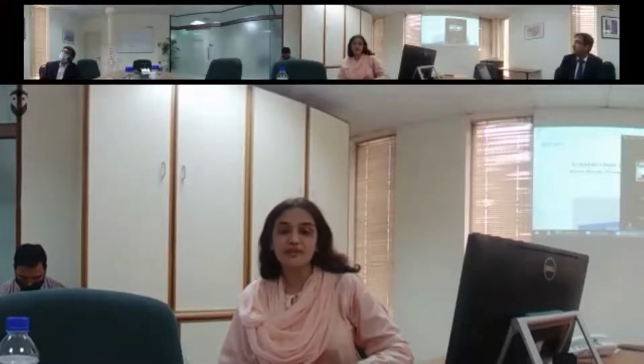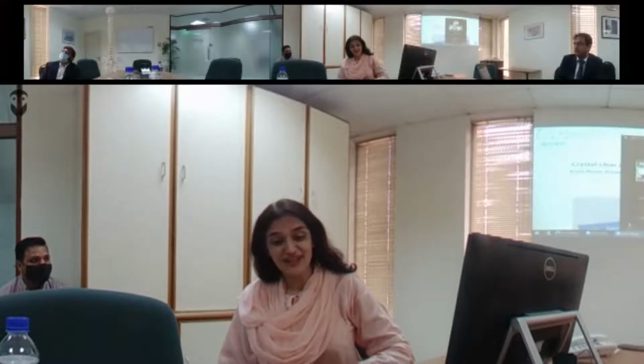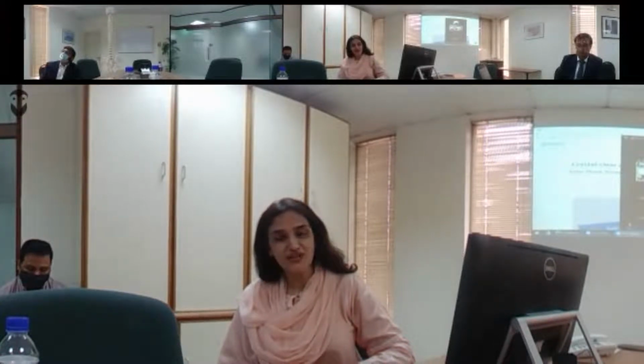While we're waiting for the participants to write their questions, I have a question regarding radiation. Dr. Zahid Wahid has mentioned digital subtraction angiography. Can you please elaborate a little bit on it? What is it and how would it help us?